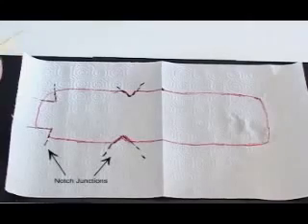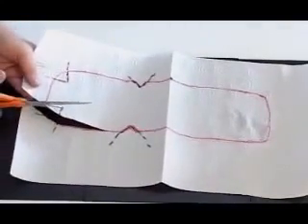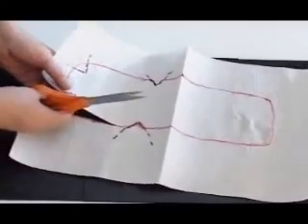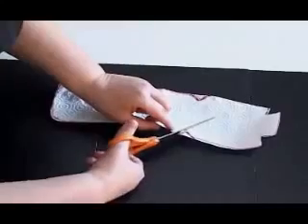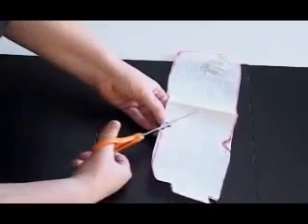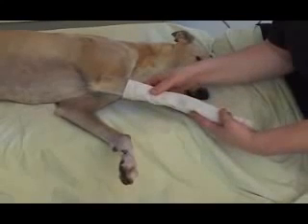After you have finished tracing your pattern and marking the specified locations, use scissors to cut out the pattern. The cut-out notches on each side of the digits will allow you to curl up the end of the splint without bunching excess material. Cut out a notch at each of the marked locations so that the thermoplastic material can be molded around the angles of the limb without bunching.